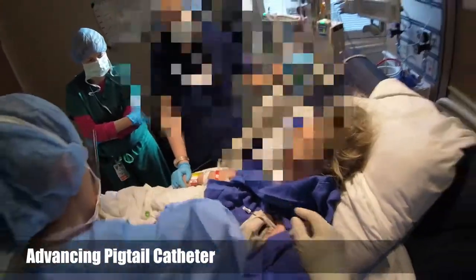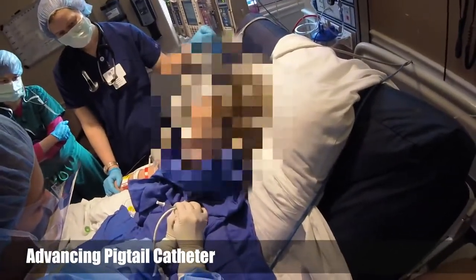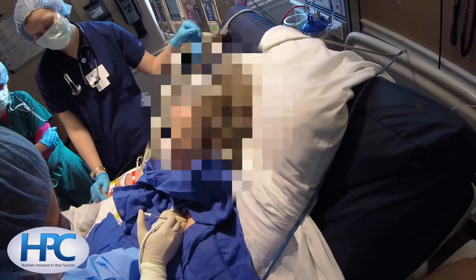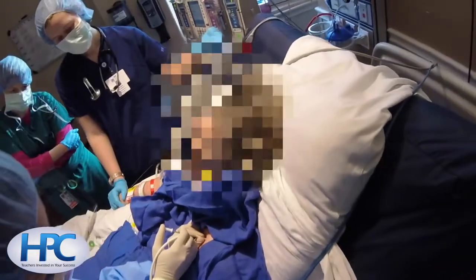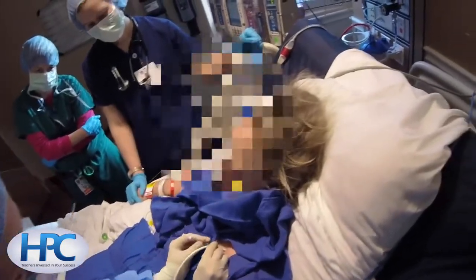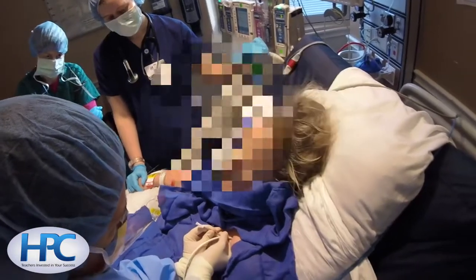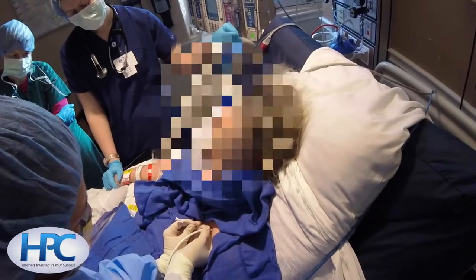Now we're withdrawing the needle, so the only thing left is the gray dilator and the pigtail catheter. These will then be inserted together an additional 2 to 3 centimeters. Now we're going to hold the gray dilator steady as we advance the white pigtail catheter over the dilator until the large opening is at the skin.